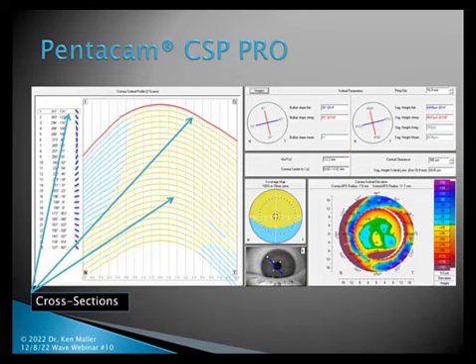In the middle section, those arcs are not decorative. They're actual data that's being plotted as a result of the sagittal depths at all of those various locations. You can see that in this particular picture, there are those 25 arcs from top to the bottom. The top one is red because you can see number 1 is circled with a square circle. Pardon my geometry there, because that's the one we're actually referencing. So that's the one that's in red.